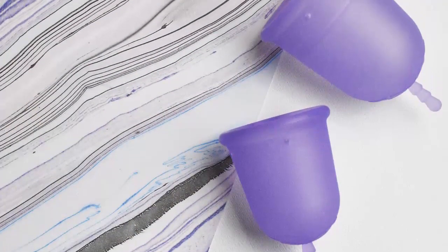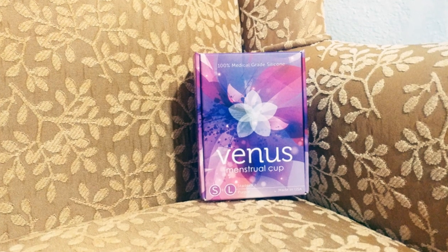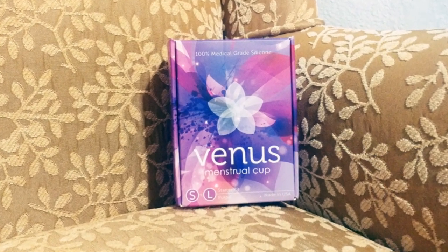The Venus Cup comes in two different sizes, a small and a large. It's made in the USA, is FDA registered, and at the time of this video is only available in purple.